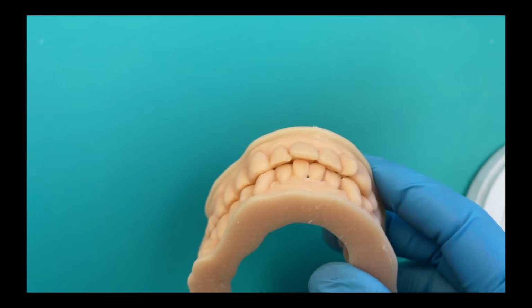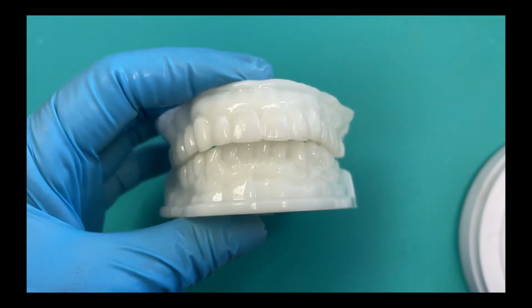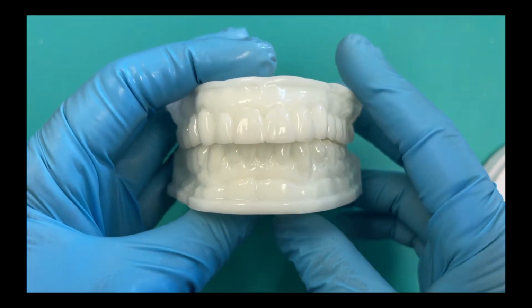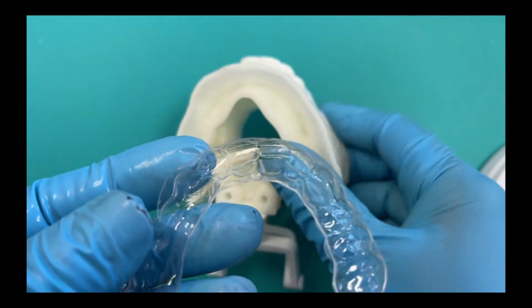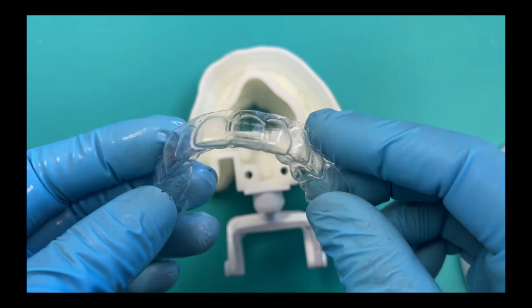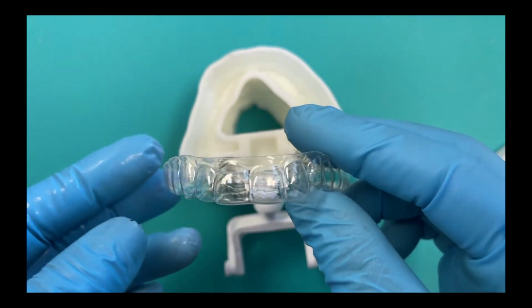And so the doctor and the patient are interested in doing something with 7 through 10. You can see nice prominence of the canines, and the bicuspids look good. So here is the DWAX from 38 Smiles Digital Dental for 7 through 10. And the patient wanted to do this as non-prep as possible. And so after the DWAX, you can see the stent that the laboratory made.